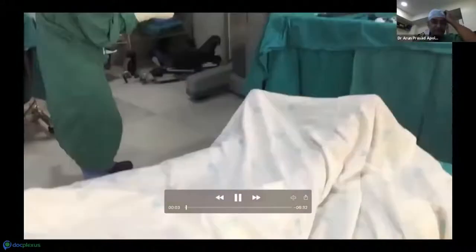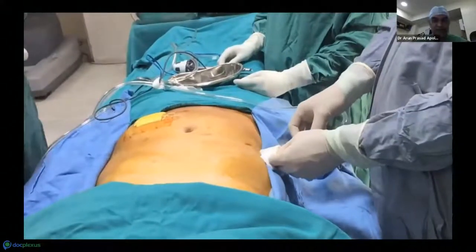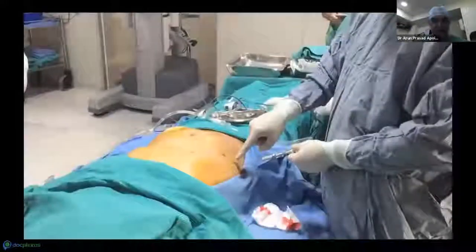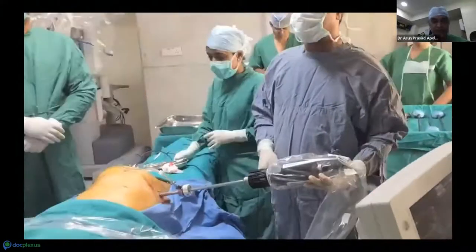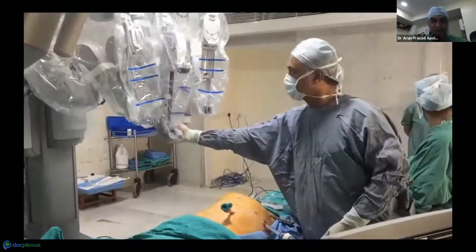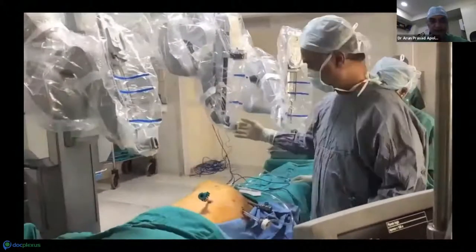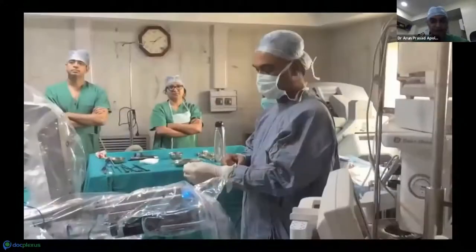Thank you for the kind words. Let me share my screen. This is a case of robotic parastomal hernia. One of the advantages of doing this robotically is the ability to easily enter the extraperitoneal plane. You can see the patient lying with a previous APR done and the stoma bag in place. The arm is brought down, the Veress needle is introduced from the right side, three ports are placed, and the robot is docked from the left side of the patient. We will be doing a three-port technique here.